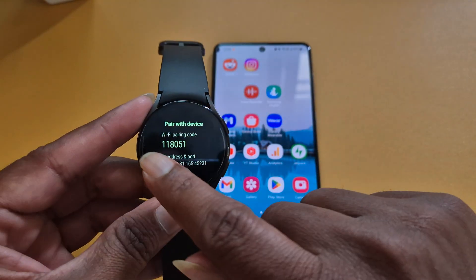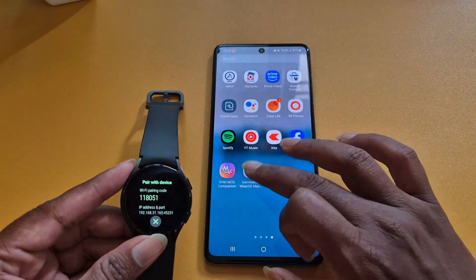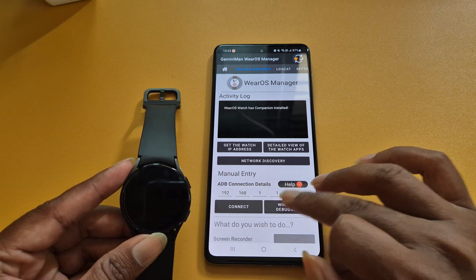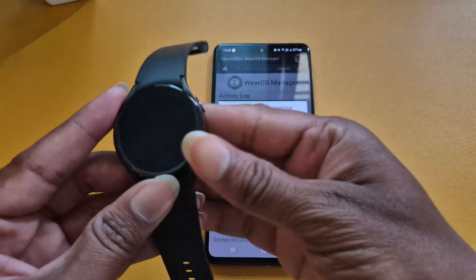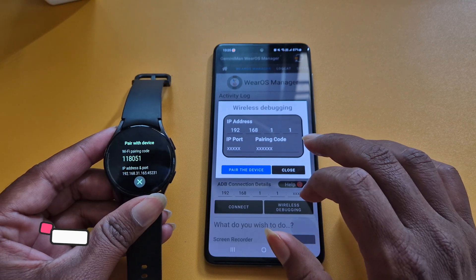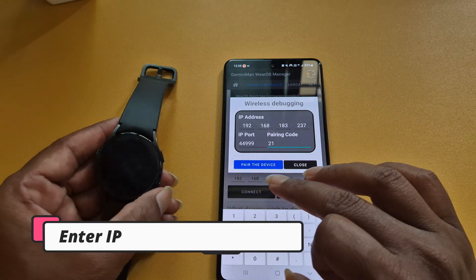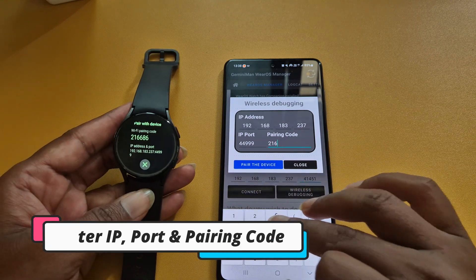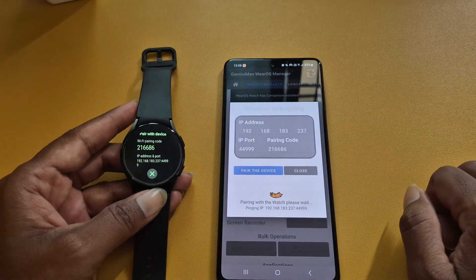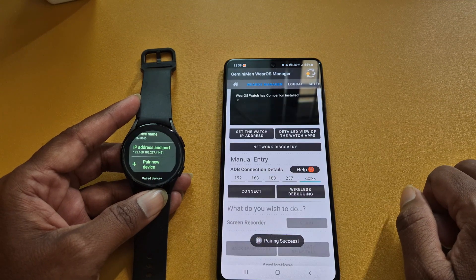Open Gemini Man app on your smartphone. Tap on WearOS Manager, then click on Wireless Debugging. Here you have to enter the IP address of your smartwatch, as well as the IP port and pairing code that you can see on the smartwatch. Type it correctly and click on Pair the Device.